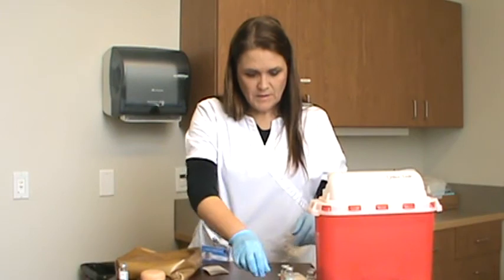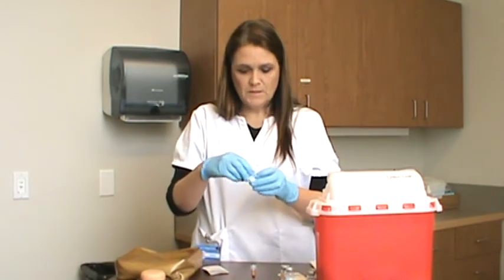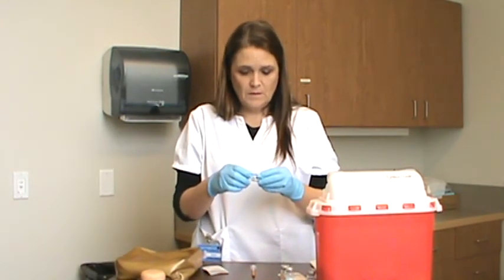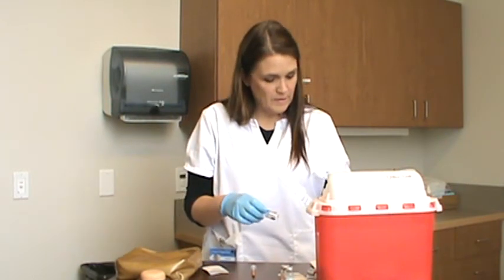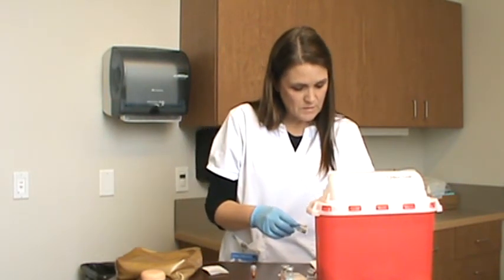Okay, my last one is the TB. This is the TB vial, and it expires 11/24. I'd make sure that on this it's 0.1.